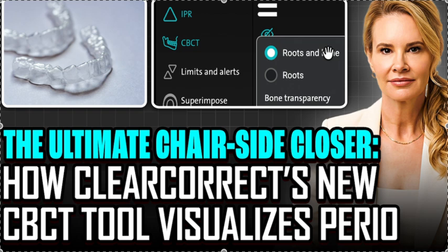And I don't think you can sell it as easier. It'll be a feature for you as the doctor. I just don't feel like it's going to be quite the feature that the iTero is. I'm just telling you the truth. So just my opinion. Now, that being said, Straumann ClearCorrect, as always, I give you the same courtesy I give Invisalign.